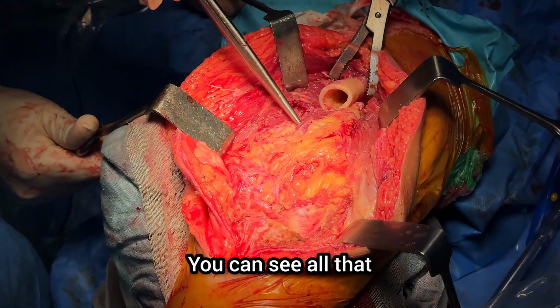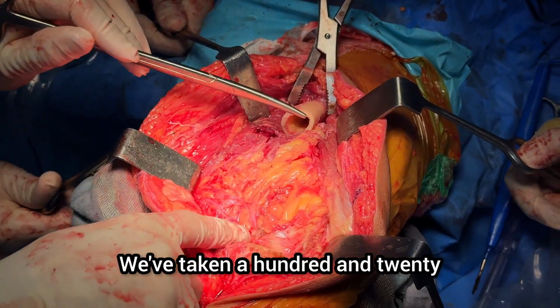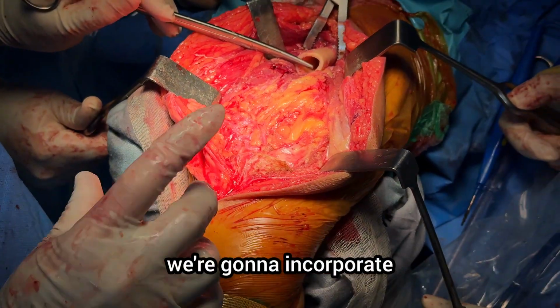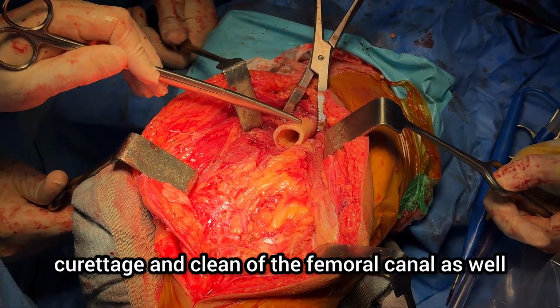You can see all that. So it's nice and clean now. There's no remnants of the tumor that we can appreciate. No remnants of the tumor. We've taken 120 millimeters of this, so 12 centimeters, and inshallah we're going to incorporate that into our distal femur. And we've done a thorough curettage and clean of the femoral canal as well.